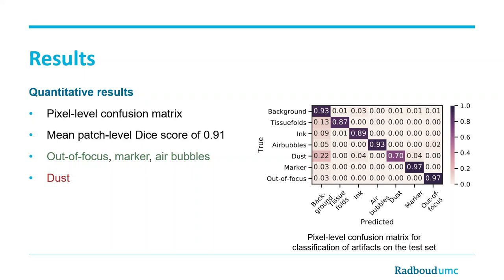From a visual perspective, these three artifact types have the largest difference in appearance compared to regular tissue. Furthermore, dust performed the worst in both pixel-level classification and patch-level evaluation. We think that the relatively lower accuracy on dust artifacts was mostly due to the difficulty of annotating the borders of the artifact. Because of the transparent gradient at the border of dust artifacts, it can sometimes be hard to set a threshold on where dust starts to change into background.